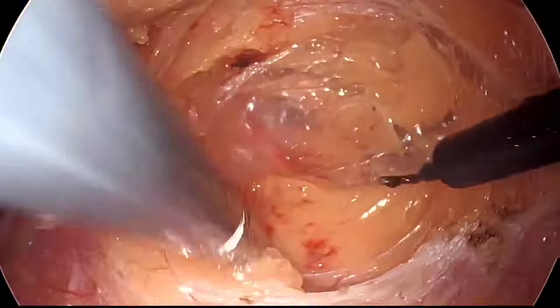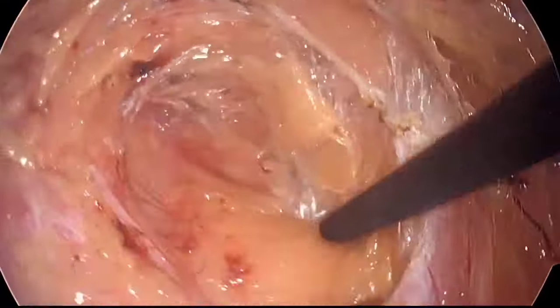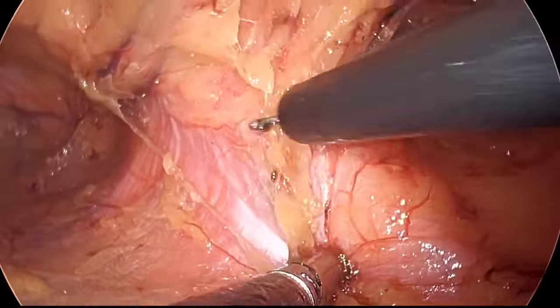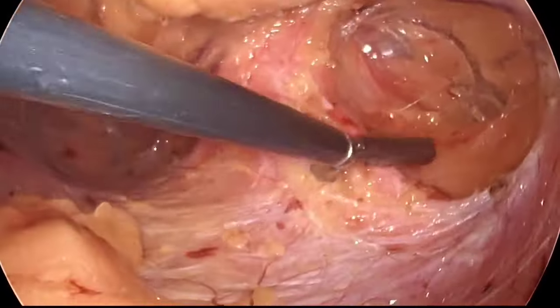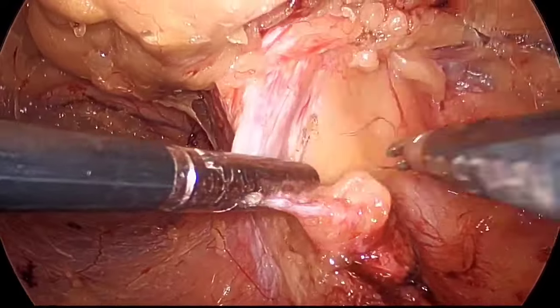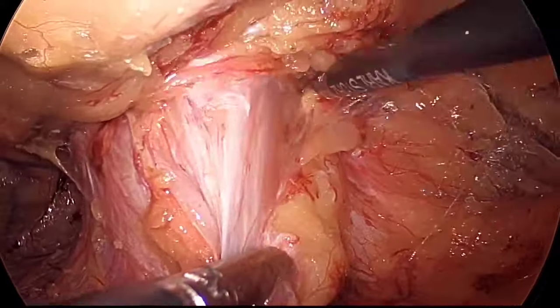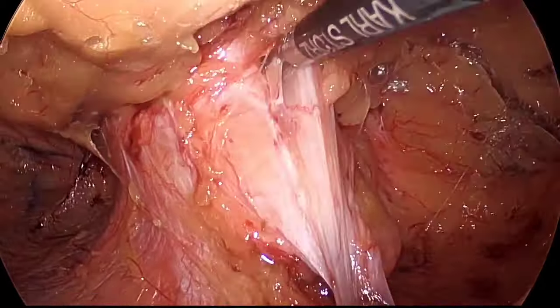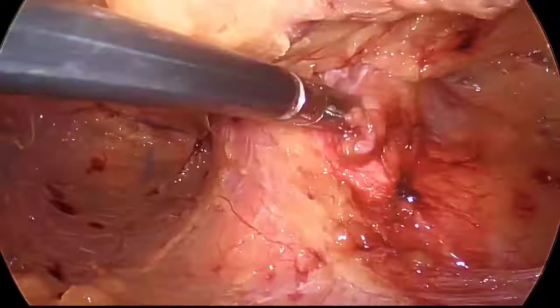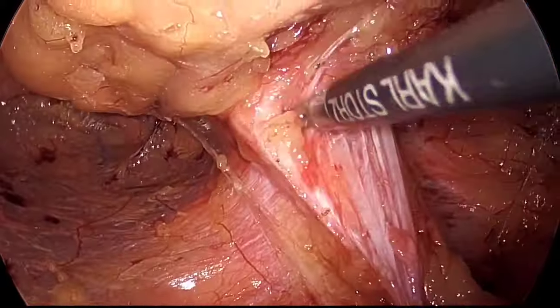So the hernia was large, but it was reducible, and actually the patient underwent open right inguinal hernioplasty 3 years back, following which there was mesh infection, and the mesh was explanted 6 months following the primary surgery, following which gradually he developed recurrent inguinoscrotal hernia, and it has increased in size. According to the CT scan, there was a 4 centimeter defect on the right groin, and on the left side there was a 1.5 centimeter defect on the left groin. So these are the defect measurements.